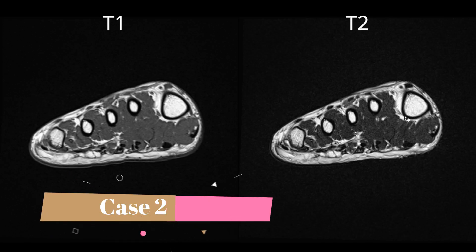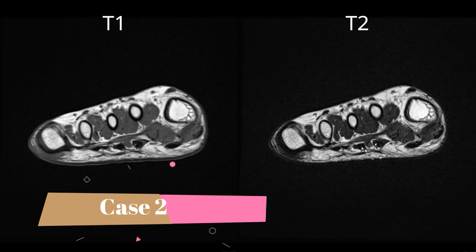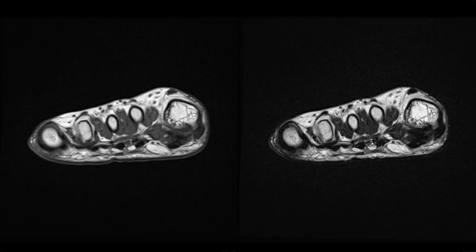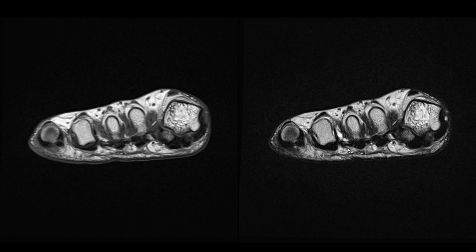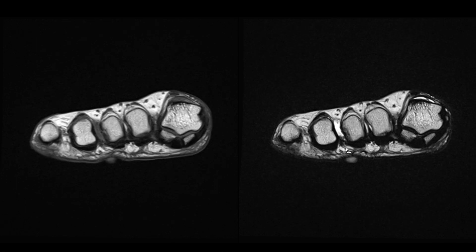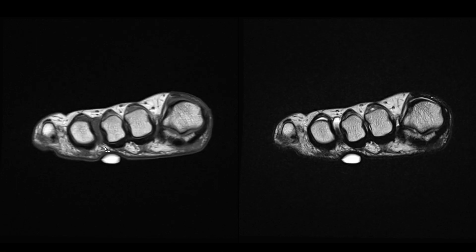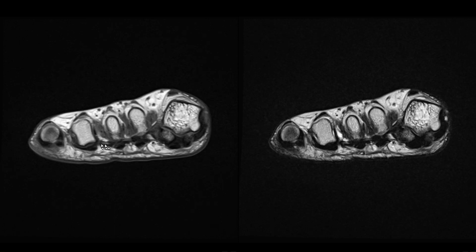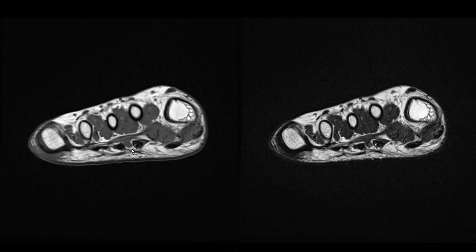This is a really nice example of the anatomy. Let's start by identifying the neurovascular bundles between the flexor tendons. You can also see the deep transverse metatarsal ligament at some spaces here. Now let's focus on the second and third intermetatarsal space.